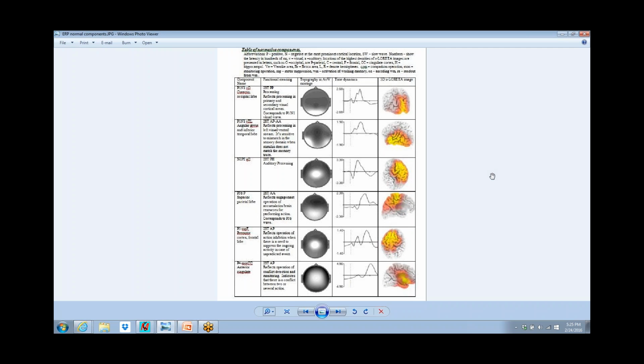So the argument that task is too much variability is in fact disproven by Alan Gevins and the EEG systems group back in the 80s. So it's really not a proper argument. The groups that have done tasks as ERPs, which for databases, the Brain Resource Company in Australia has ERPs in their norms, and they have about 2,000 normal people in the database and about 10,000 different clinical groupings.